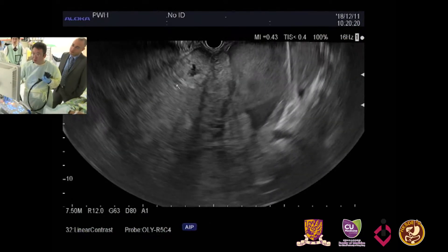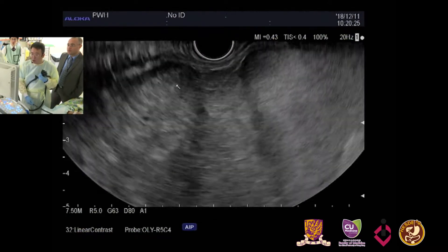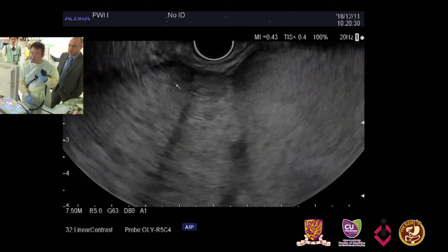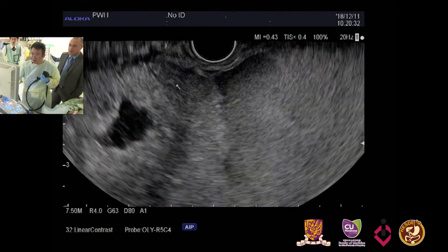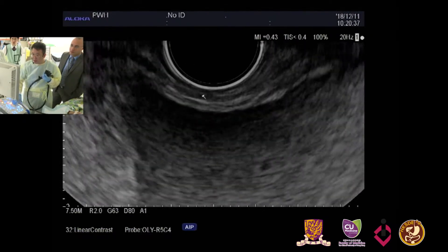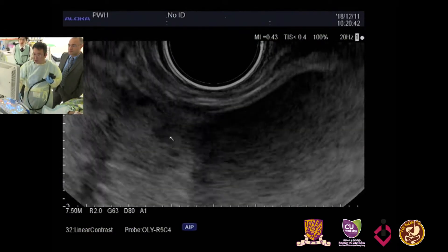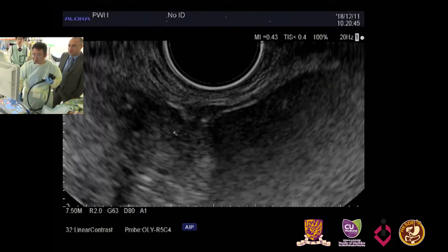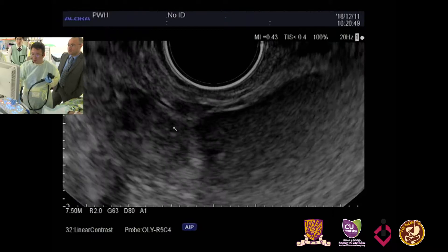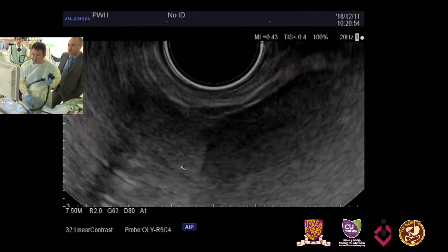We had to check the layering of the wall. Although our endoscope showed nothing abnormal in the stomach, I magnified the picture and you can see the muscle layer continues into the tumor. So I think it originates from the stomach — it is an exophytic tumor, which is very commonly seen in gastric GIST.